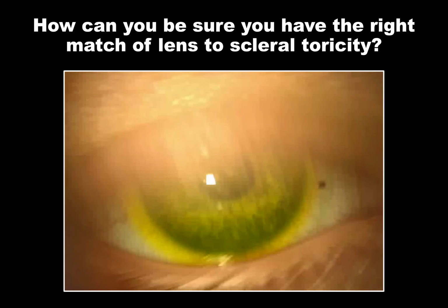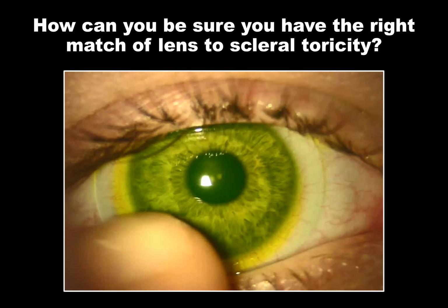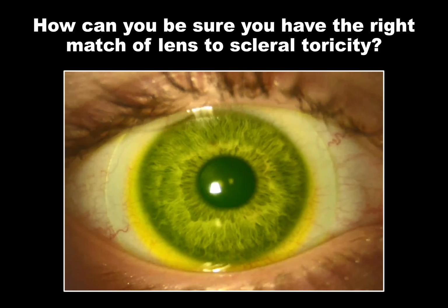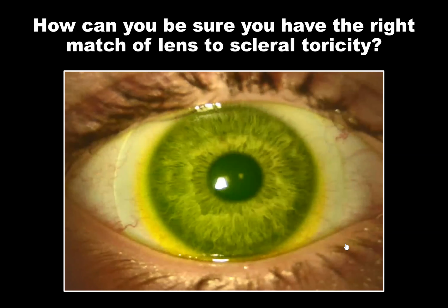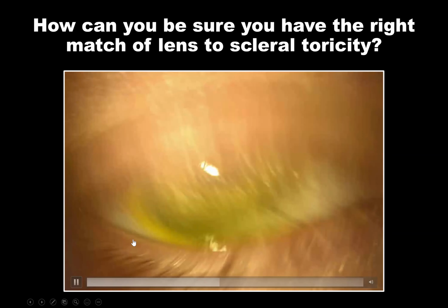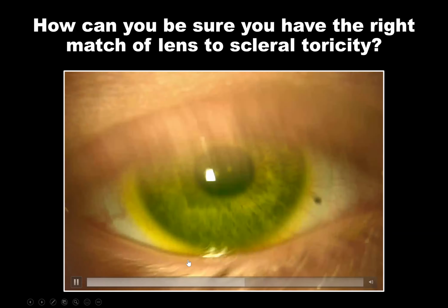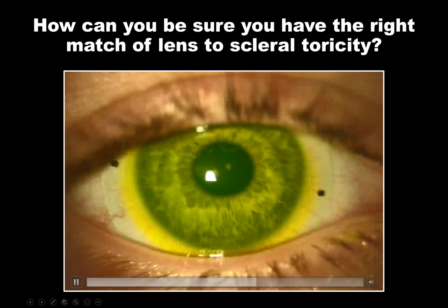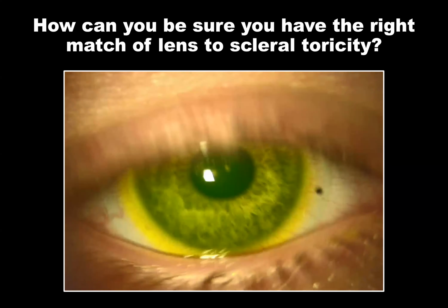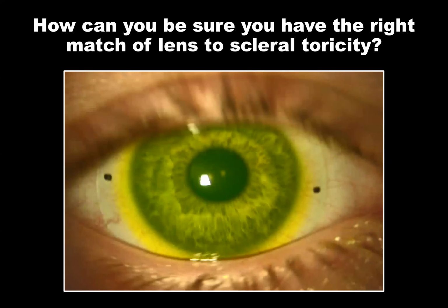In this lens, we're talking about the 16.5 having only 150 microns of difference between the axis with the scribe, so that's the flat meridian here, and the axis without the scribe, that's the steep meridian, somewhere around 12 and 6 o'clock.